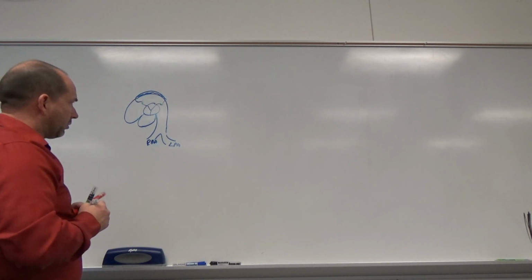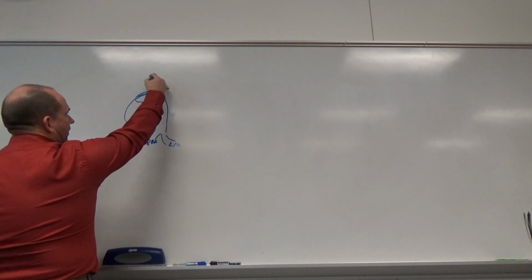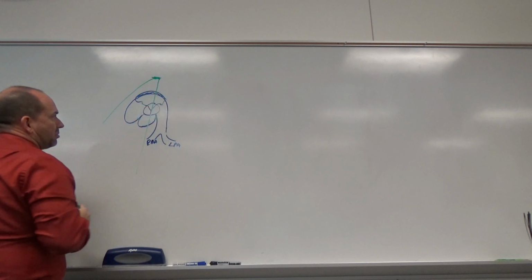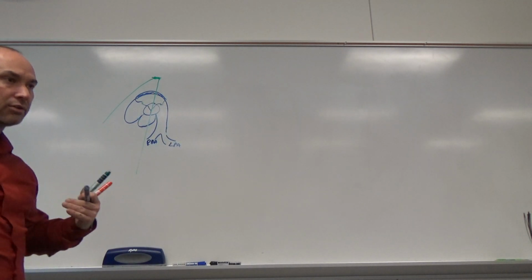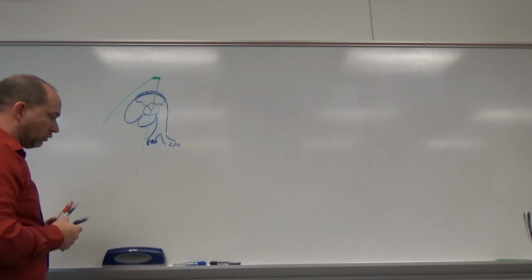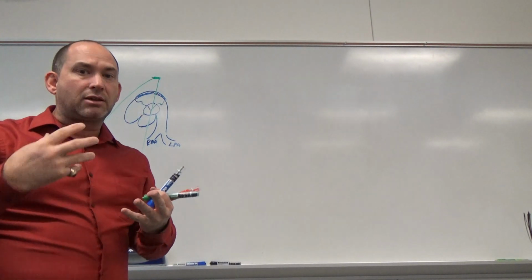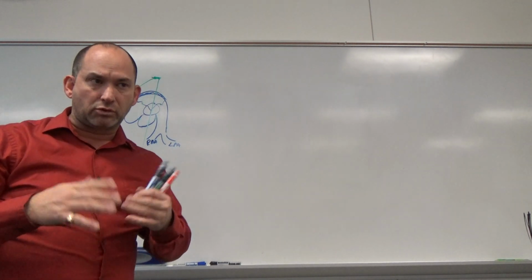Okay, so next thing we're going to do is go to the tricuspid valve, and when I focus on tricuspid valve, here's my transducer at the top. I'm going to sector size down, probably about like this. I'm going to probably cut off a good portion of the pulmonary because at this moment, I don't care about it. So now I'm going to look at regurgitation and leakiness of the valve. Any valve structure, we want to look at the structure of it. We want to look at any thickening, any calcifications, any masses that are attached to it, or just any other structural problems with it.